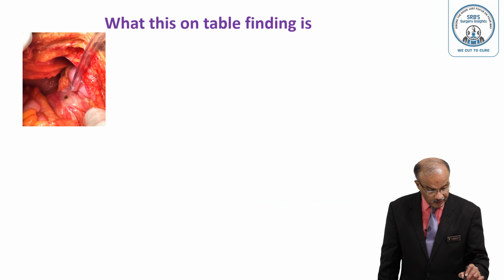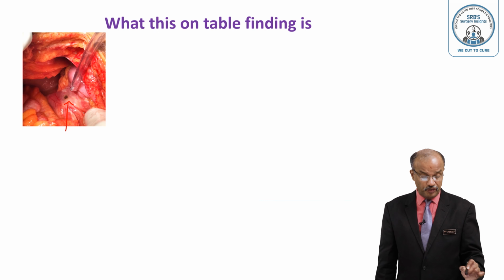Dear students, today we will discuss an on-table finding, how it looks. An emergency situation. See that suction tip is there. It's a laparotomy wound. You can see the stomach, there is a hole here. See that hole? That is the perforation.